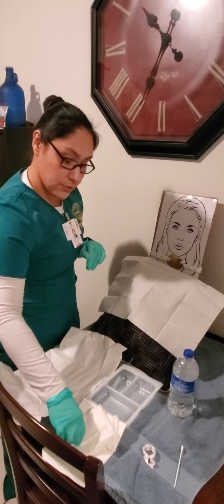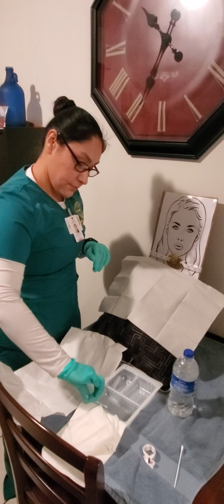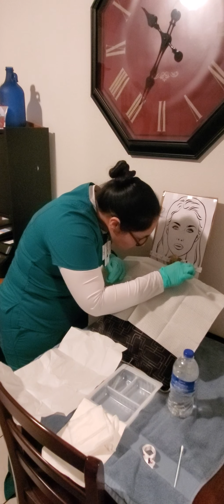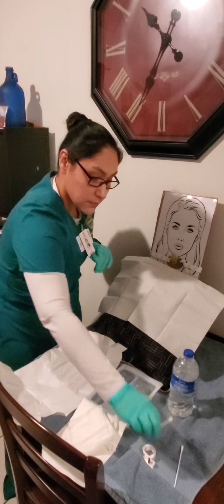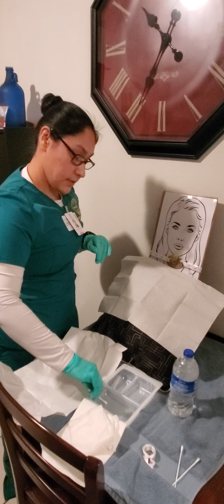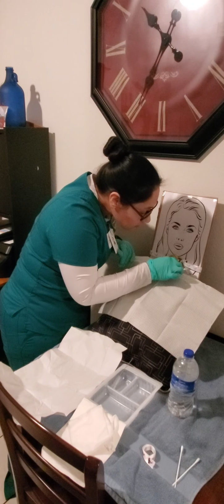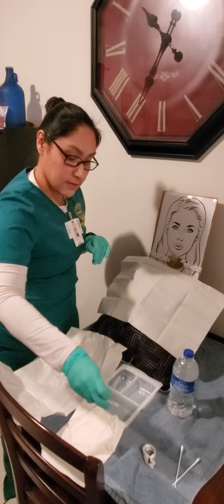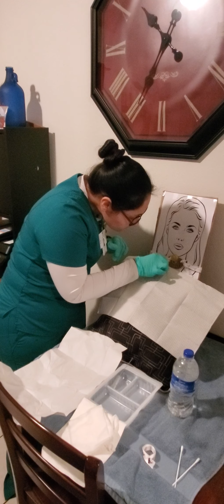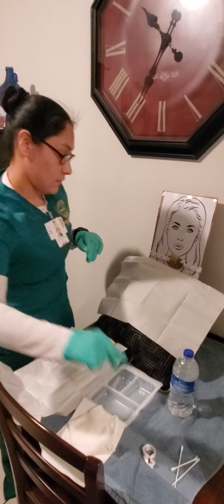Dispose. Make sure that you do get a new cotton tip applicator for every area. Okay, dip it in the saline. Okay, and then with the third applicator, dip it into the saline, and now we're going to clean the faceplate. Okay, we'll dispose of that. Get another one, dip it into the saline. Dispose of that.